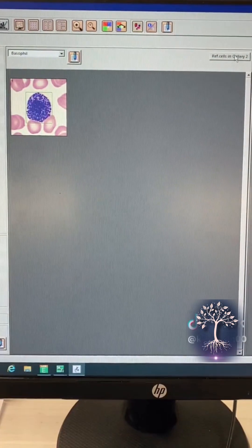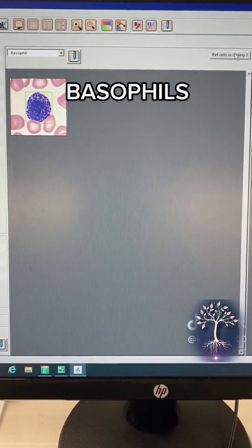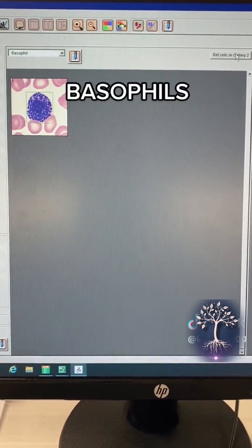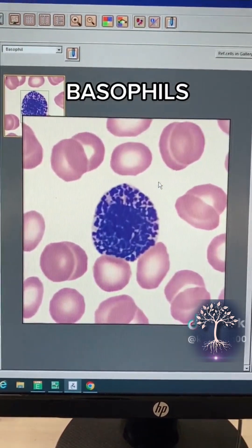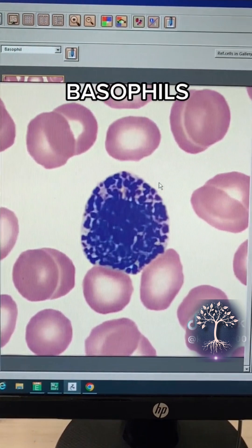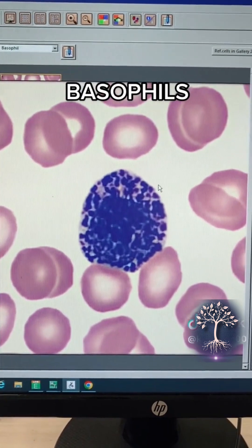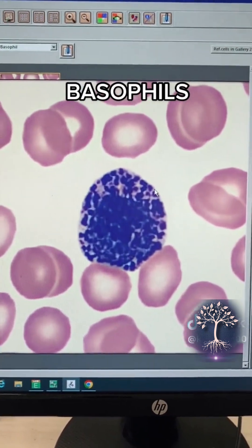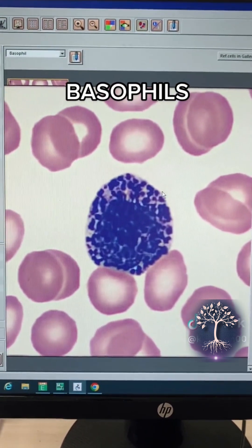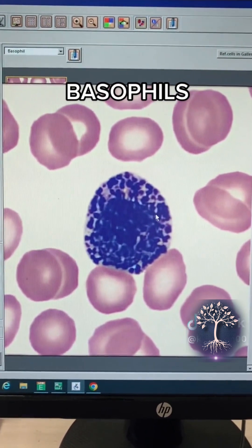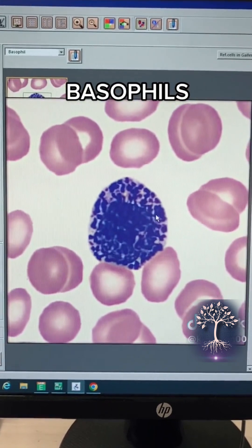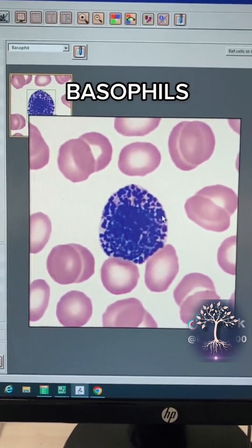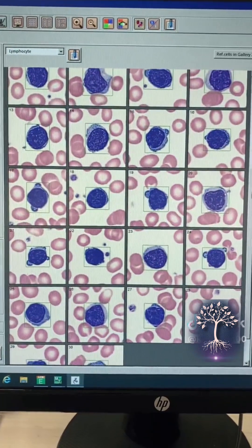This next cell is a basophil. Basophils are the least common white blood cell. It's kind of hard to see the nucleus of a basophil because there are so many granules in the cytoplasm. These appear to be a dark purple and sometimes even a dark black.